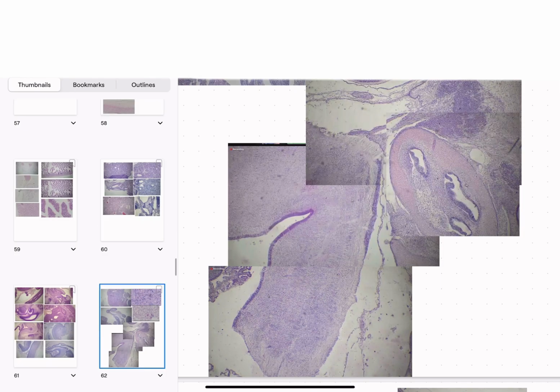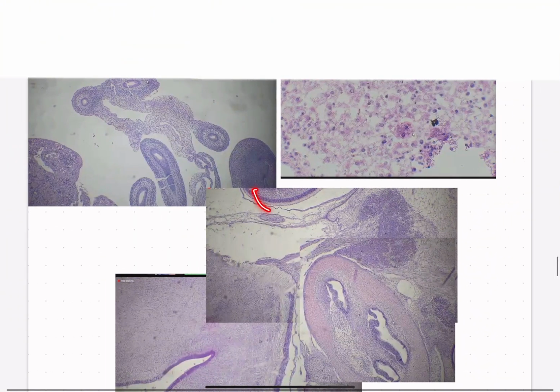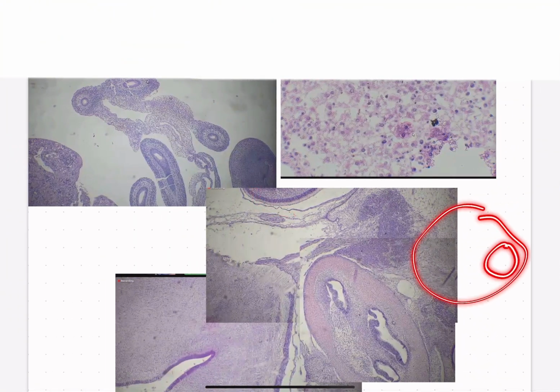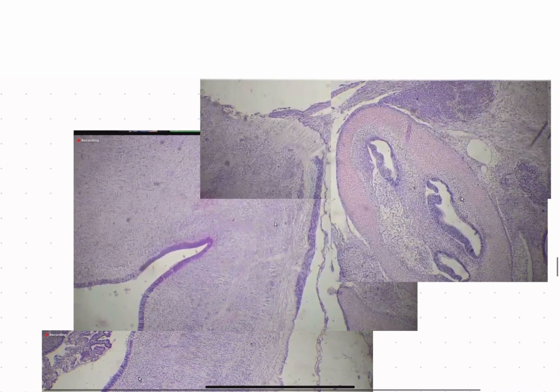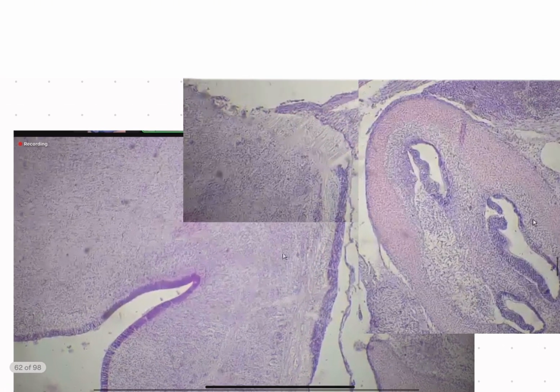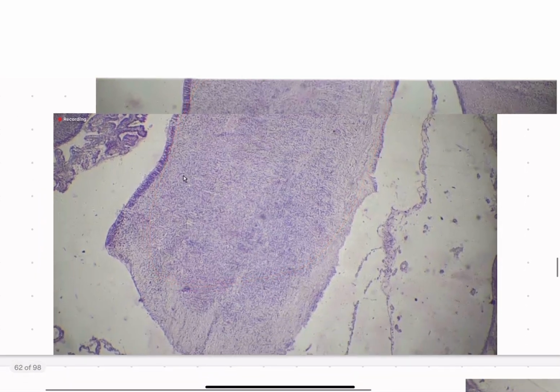If we look at other images, we can definitely see it more clearly, but this is what it would look like under the microscope, because again, we're first going to see the eye, which would be here, and then from the eye, we're going to go towards the bottom left area, towards the fourth ventricle of the brain to see the pons. This is how zoomed in it will be, the pons. Hopefully that makes sense, almost looking like a kneecap, the lamina quadrigemina area, as well as the medulla oblongata. Like I said, this is how zoomed in it will be.